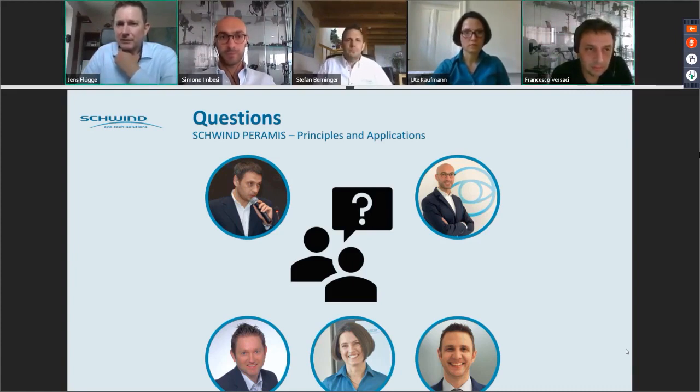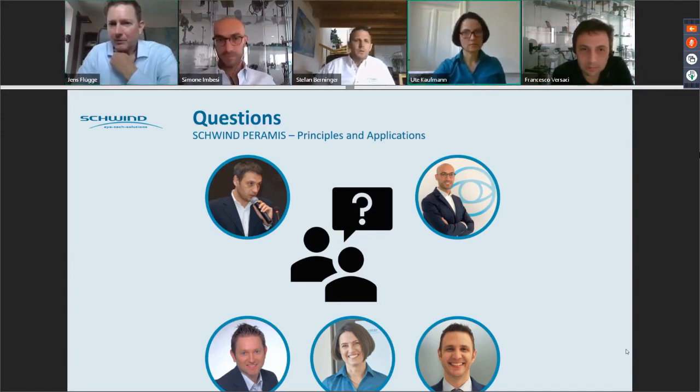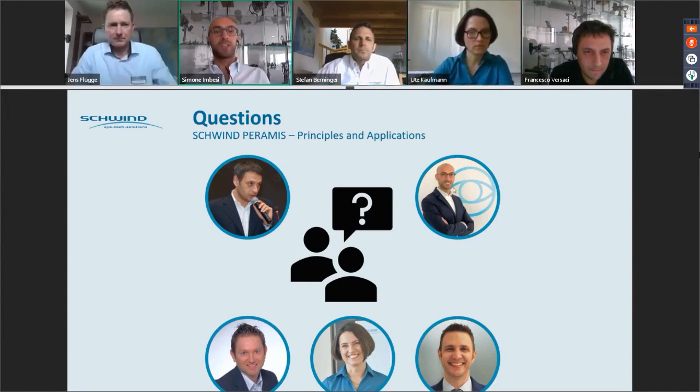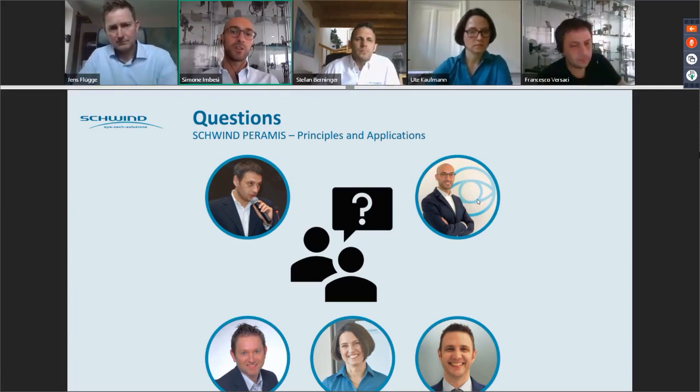Yeah, very good comment. Okay. Stefan, do we have a last question from the chat? Yes, a last question. Which factor is the first priority to choose the best image? I think this is related to the statistic. I think we have to evaluate several parameters. There's not only one parameter to be taken into consideration.